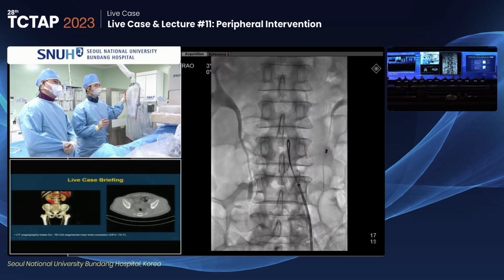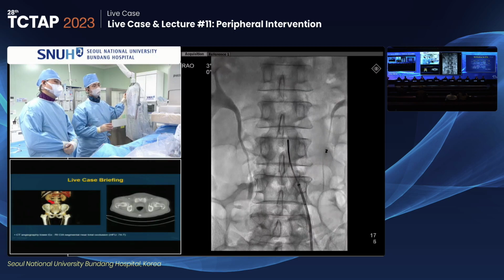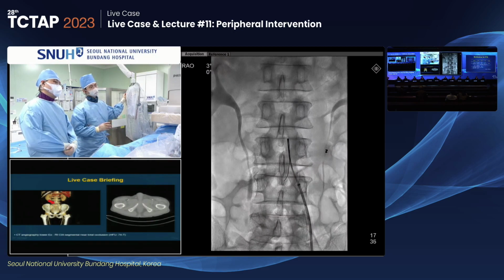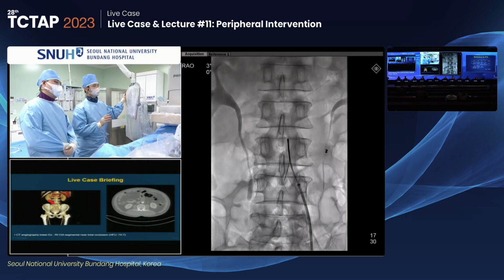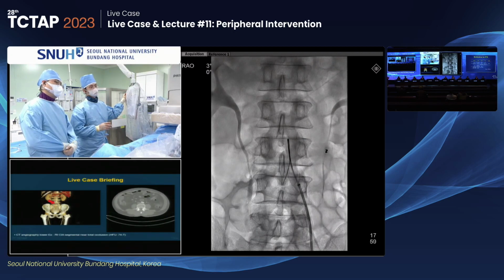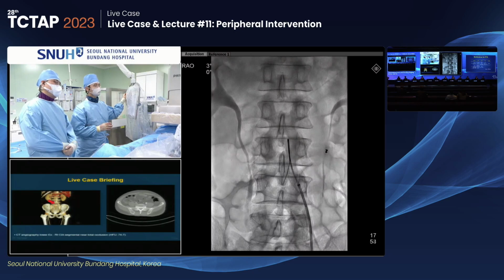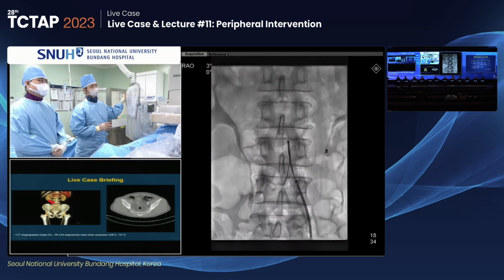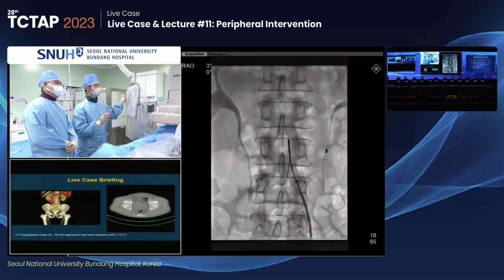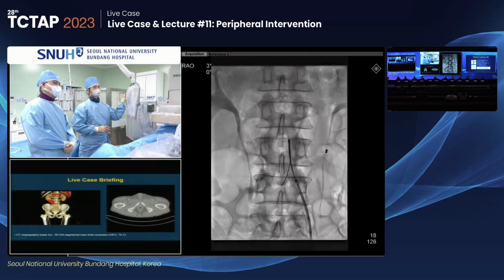But it doesn't penetrate. I frequently choose this Omni catheter, and inside the Omni catheter, I insert the 018 wire with support of a CXI catheter. And using this, I can usually penetrate the proximal stump like this.